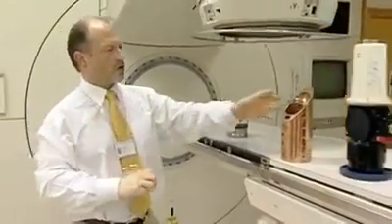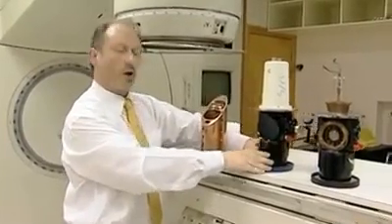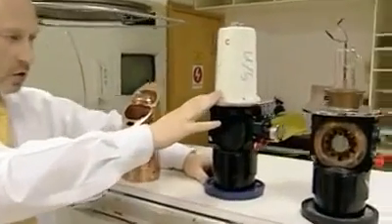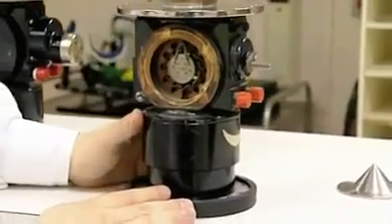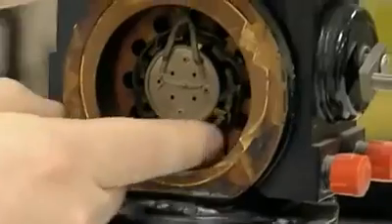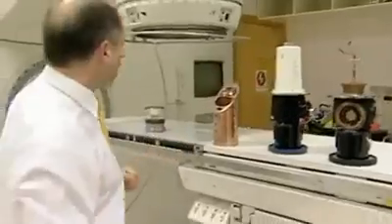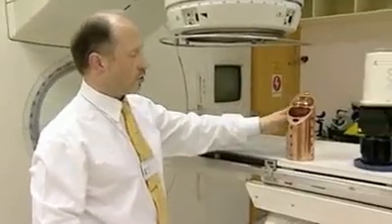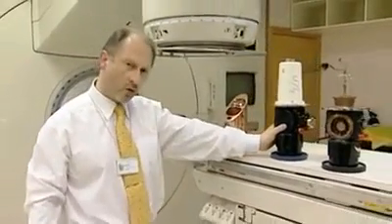The electrons are accelerated down the structure by pulses of microwaves from a magnetron. Here we have an example of a magnetron — this is a cutaway example — and if we look inside it, we can see the accelerating cavities. So the electrons from the gun are accelerated down the accelerating structure by the pulses of microwaves.